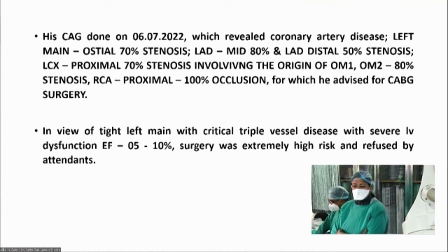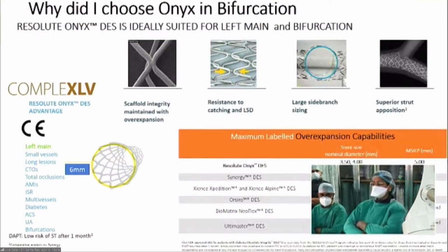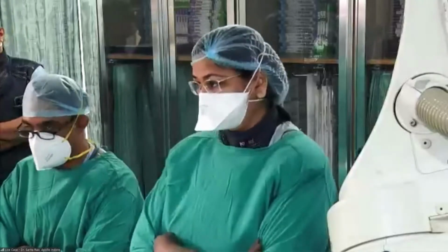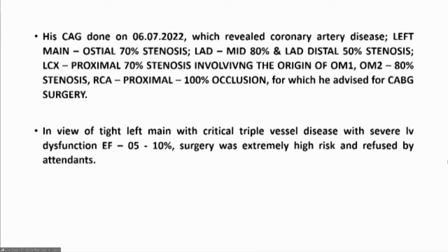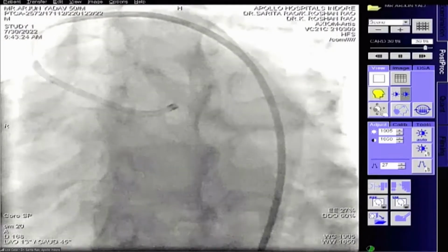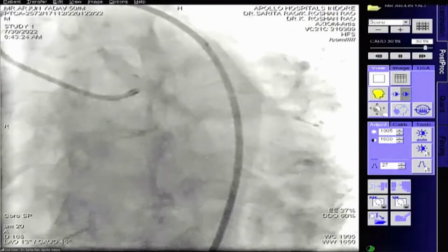Next, please. So let me show you the angiogram now. Can you play the angiogram? Hemant, can you see the angiogram now? No. Not yet, Dr. Sarita. Can somebody play the screen now? Can somebody play the angiogram screen? Yeah, we can see the angio.